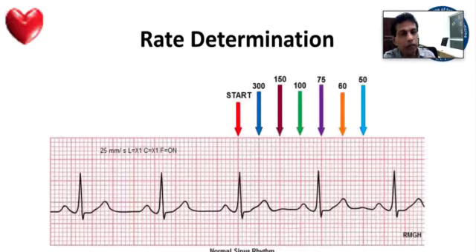They are not health professionals. For them to read and contact the doctor, only these machine interpretations are there. But I normally look at the heart rate or ventricular rate that is printed. It is usually correct. But if it is not there, you should be able to calculate the heart rate by looking at an ECG.